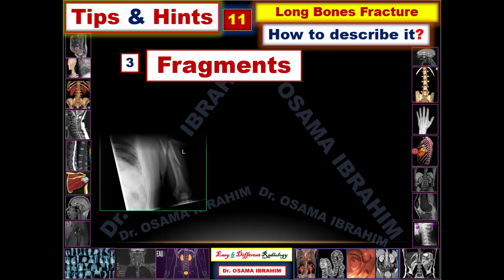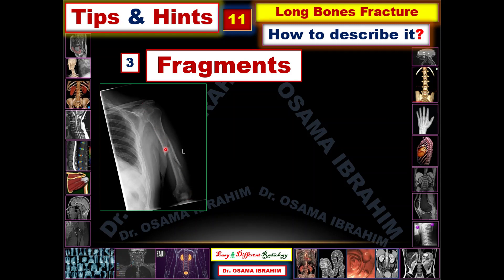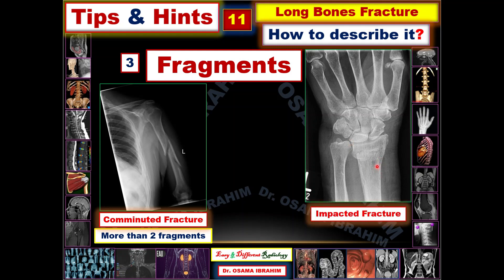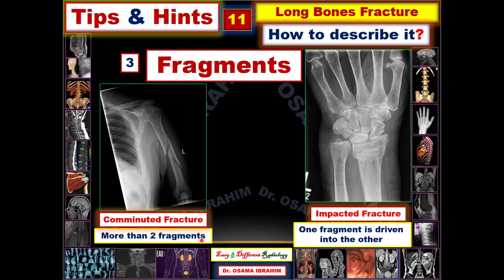The third item is fragments, and this is a very important item. If you look at this humerus — the left humerus — you can discriminate three parts of the bone. If there are more than two bone fragments, it is described as a comminuted fracture. If the bone is impacted into the other bone, like this radius, it is described as an impacted fracture.